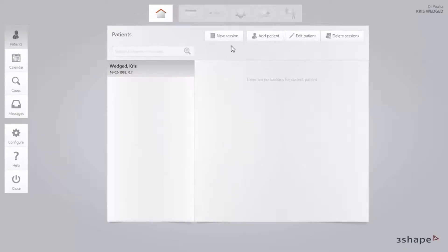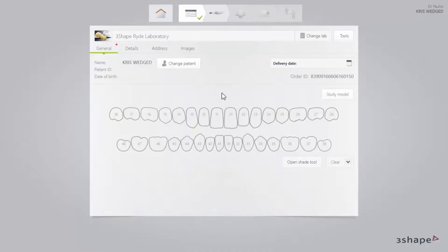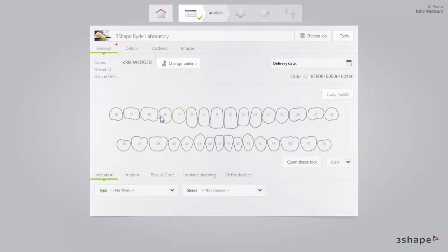Starting on the Patients page, click New Session and select the lab. If you have only one lab, this lab is automatically pre-selected. The order form will appear. First, mark the tooth with implants. These teeth will now have a green outline and the tabs with indications will appear on the bottom of the window.